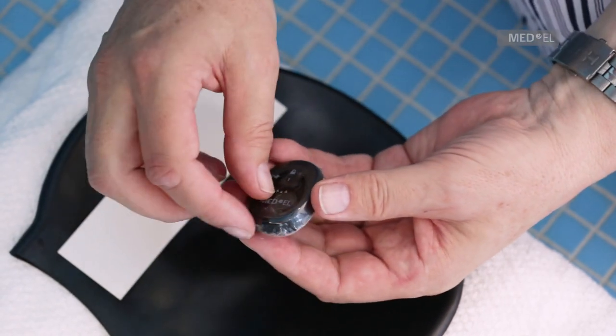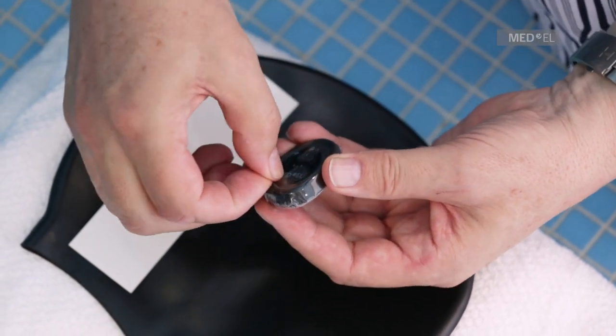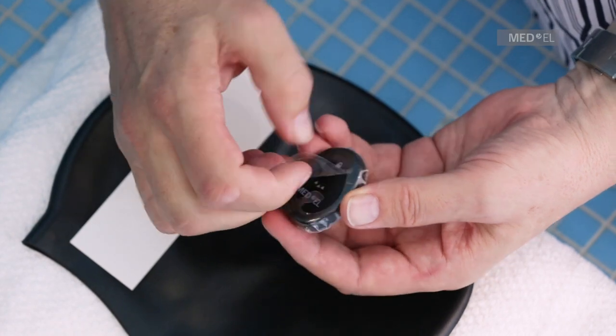To remove waterware, gently peel off the adhesive strip and discard. Use the circular flap to remove the cover from the processor.